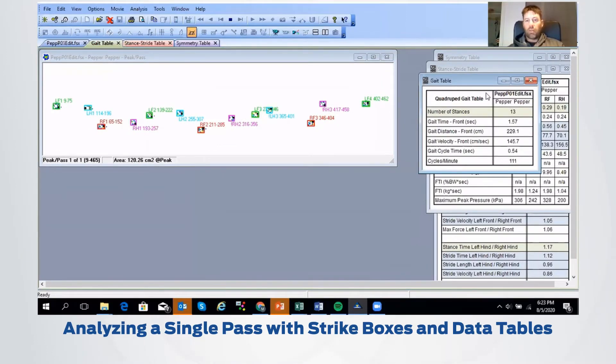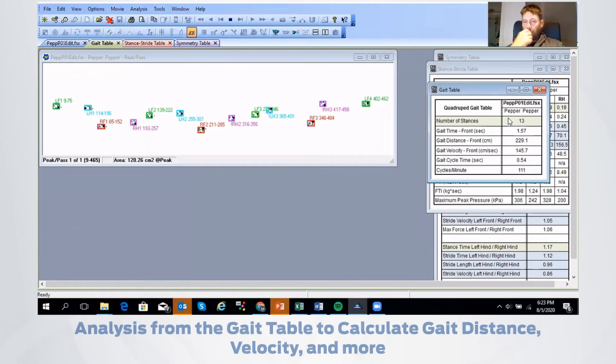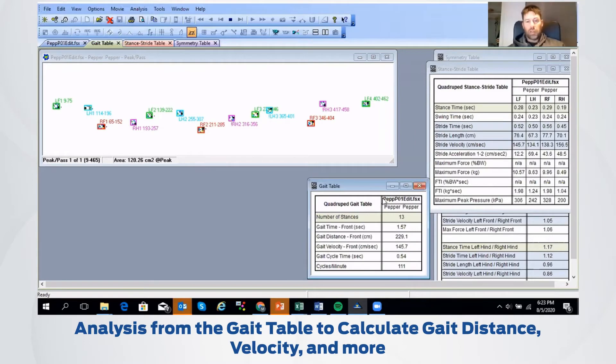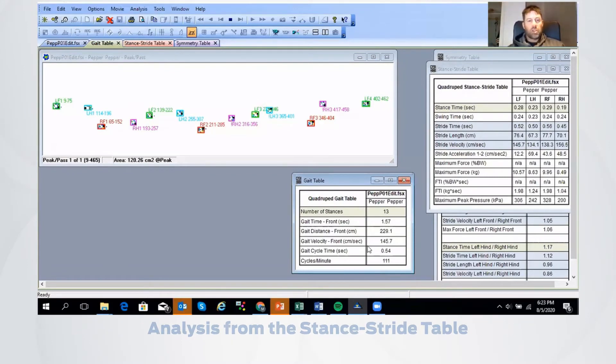It creates those boxes and gives us our tables — you'll see three tables here: a gait table, a stance stride table, and a symmetry table. In this case, we're seeing the number of stance phases is 13. Our gait time is about 1.57 seconds, and the distance covered was almost two meters. We'll have a calculation of gait velocity, gait cycle time, as well as cycles per minute. If you're looking at an injured dog or a dog in recovery doing rehab, you can track changes with regards to that.